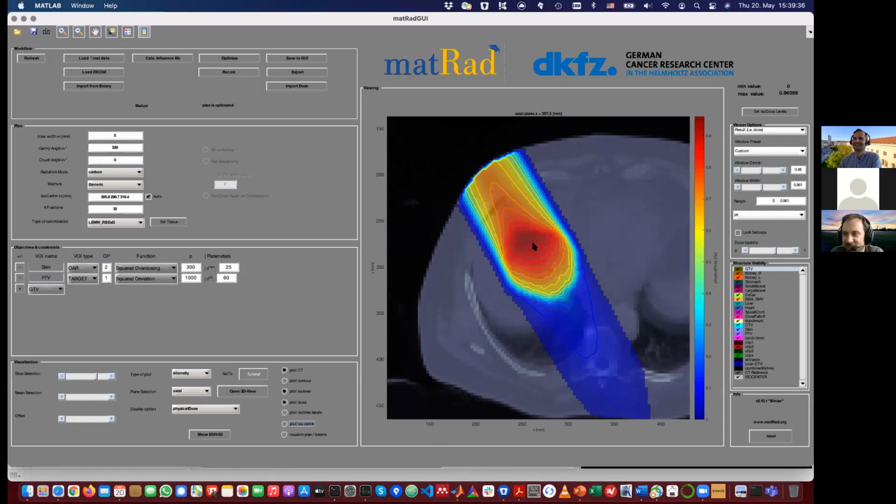Just to answer this: usually if a program eats up too much memory, since we do not write anything to the disk in particular, it will just make it super slow, and maybe the application will crash or freeze, but there should be no lasting damage to your computer, because we do not write on your hard drive and fill it completely or anything like this.